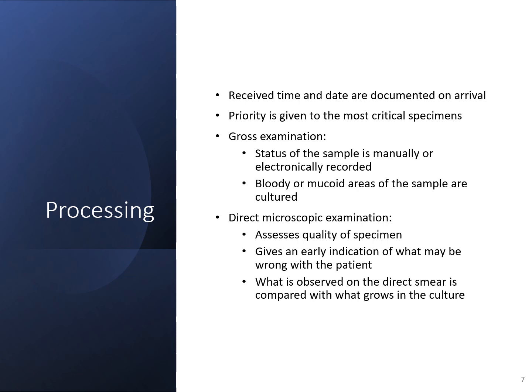Once the specimen is received into the lab, it should be documented with the date and time that it arrives. This is important so you can compare the collection date with the received date, check for any discrepancies, and track the specimen as far as when it was received, when it was cultured, and when the results were sent out. So it gives you a time frame on the specimen.